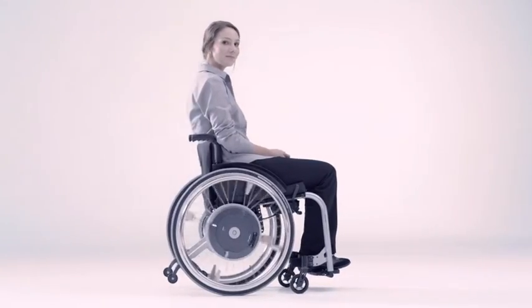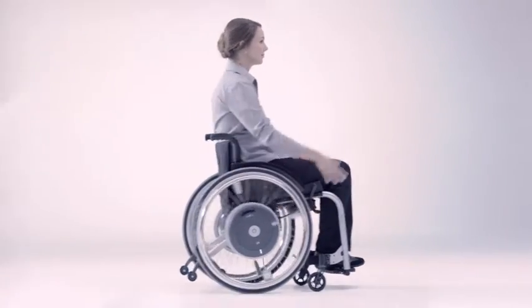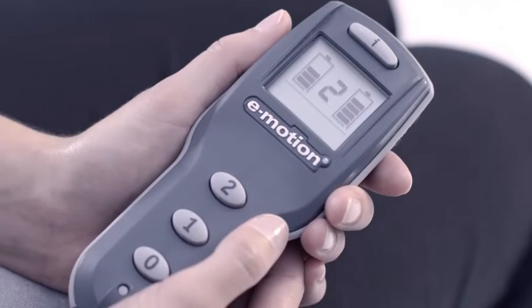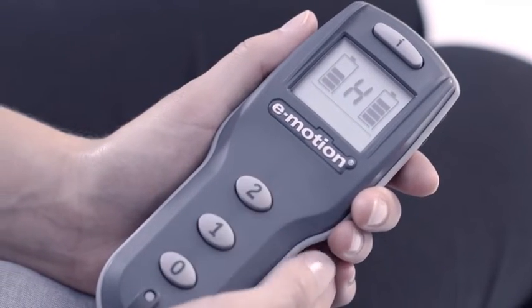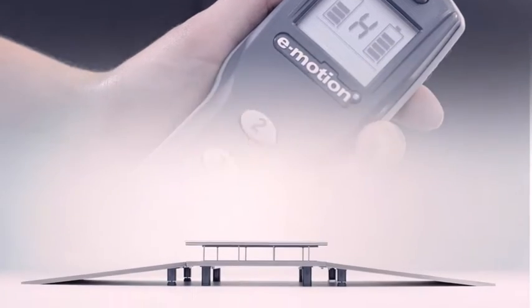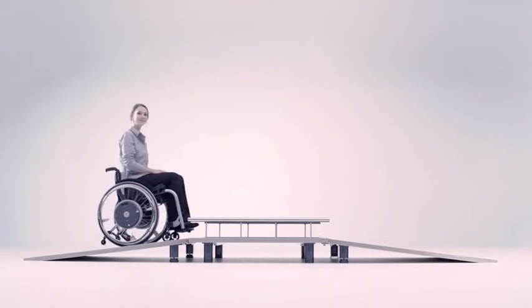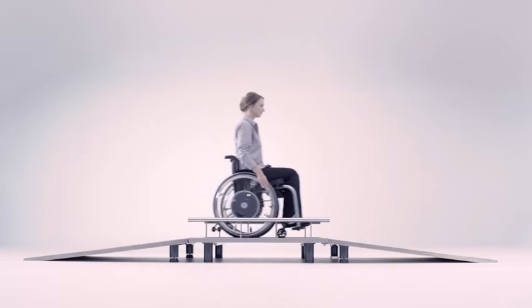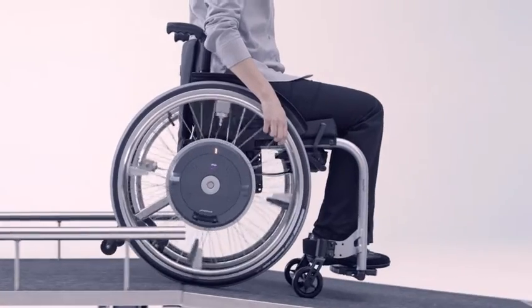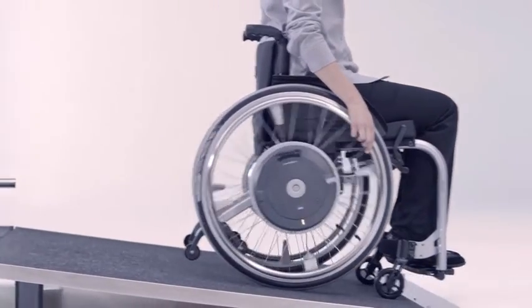Thanks to progressive drive technology the motors run without a sound. A rollback delay activated at the push of a button keeps you safely in position when going uphill. When travelling downhill the power assistance also boosts the braking pulse to give you greater safety.